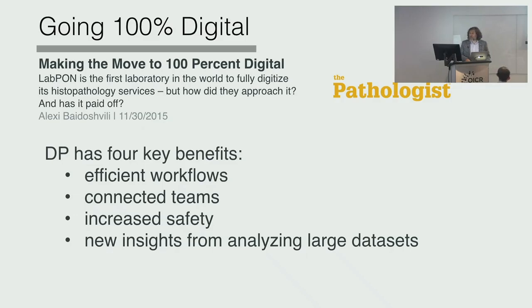So if you are looking for something specific, you cannot go in the basement of the hospital and grab 1,000 glass slides, bring them up, put them one by one under the microscope and show it to 10 different pathologists. You cannot do that. But in a digital context, this would be a matter of 30 minutes, full-scale analysis.